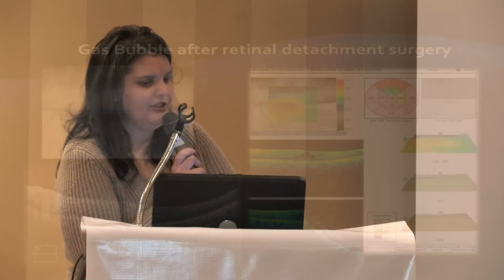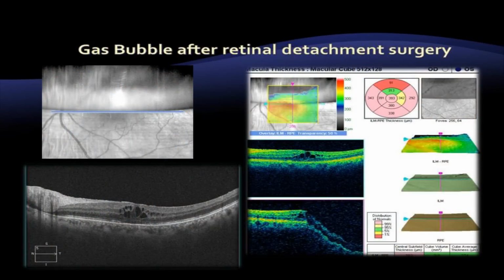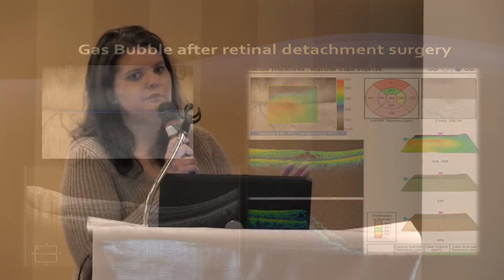Same thing here. This is a patient who had a retinal detachment, and this is what I'm saying, we can always make adjustments. If there is movement, we can always make adjustments to the scan. If you feel that you can't hold still, or you can't hold your eyes open, or if you need to blink, whatever, it doesn't mean we can't make the adjustments.